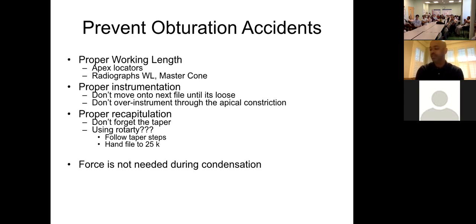They say that there's nothing that can interfere with the apex locator as far as the canal system being wet, et cetera, et cetera. I just recommend you try to dry it. That's just going to give you the most accurate, reproducible reading, okay?